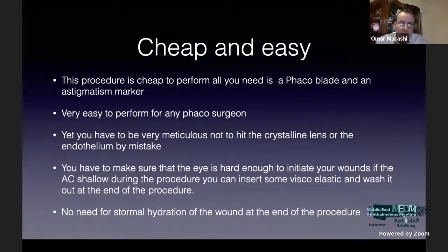You have to make sure that the eye is hard enough when you're initiating your wounds, just to make sure you do not enter the eye suddenly and cause any trouble. And of course, no stromal hydration is needed for the wound at the end of the procedure.